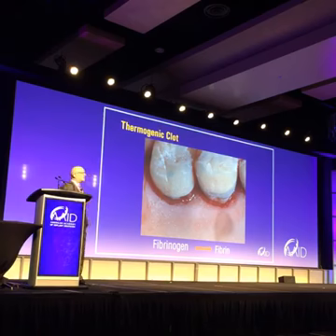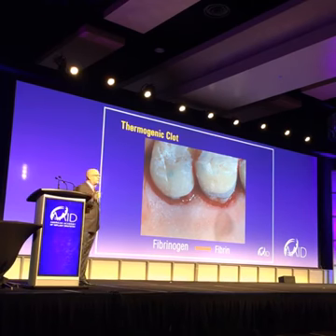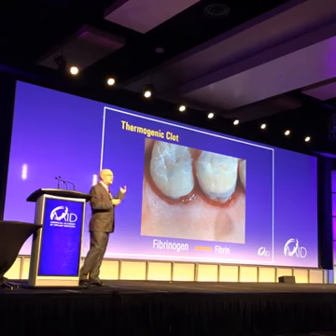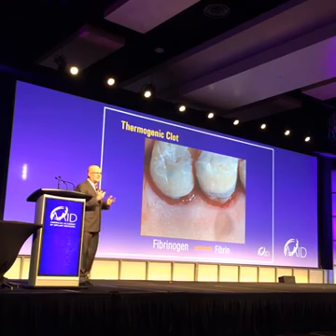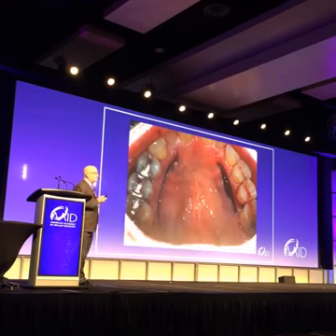This is just an example of the fibrin clot. You can see how sticky it looks. And you can see what that snow is. That's porcelain powder during the occlusal adjustment phase. But look how that clot is stable. It's not moving. This is done with a high speed on air only, obviously. We don't want to wash away anything, but you can see that that clot is sticky. It's a gelatinous mass that acts as the patient's own barrier.